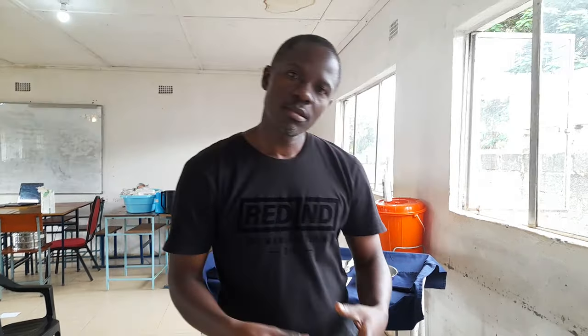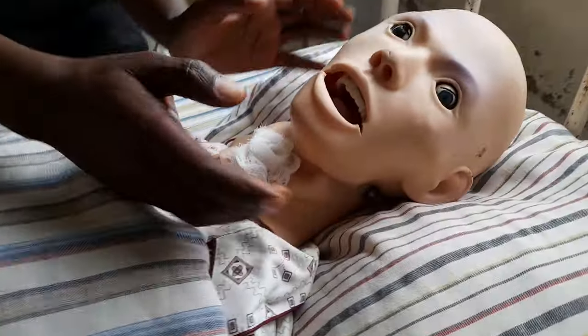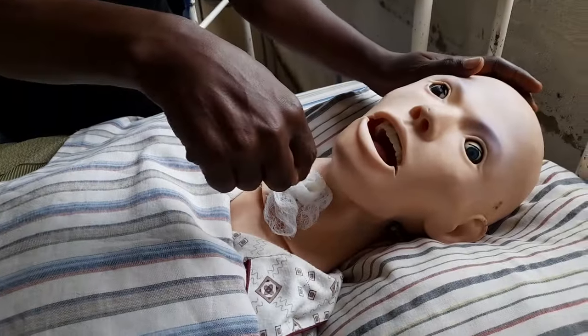This procedure focuses on suctioning. A patient has a tracheostomy tube and we are supposed to suction through there. Suctioning while performing tracheostomy care is a sterile procedure, because we don't want to introduce any infection into the tracheostomy tube, as it goes all the way in. So we need to ensure that it's a sterile procedure.